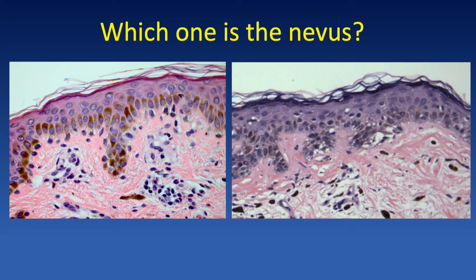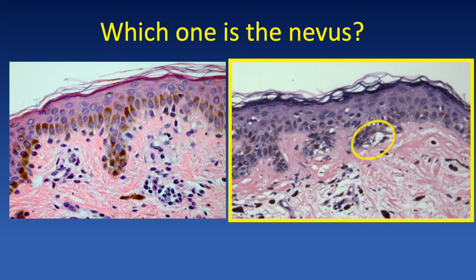So, which one of these two figures is depicting a nevus? Trainees, pause and select. Remember, the junctional melanocytes tend to have that exaggerated clearing around them. So when we have a coalescence of 3 or more melanocytes forming a nest, that clearing tends to be more exaggerated.